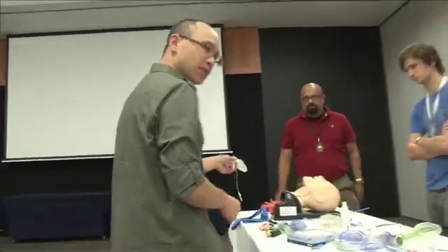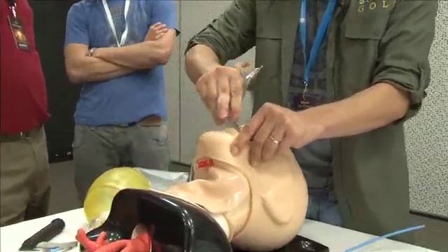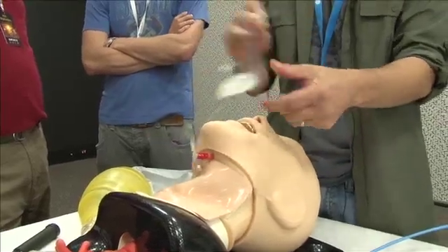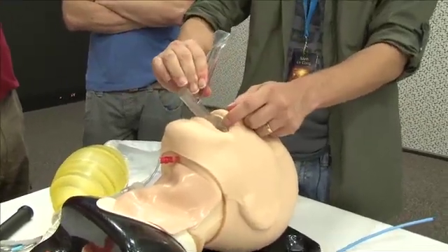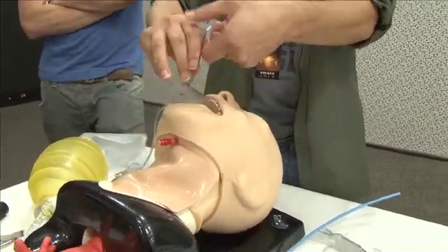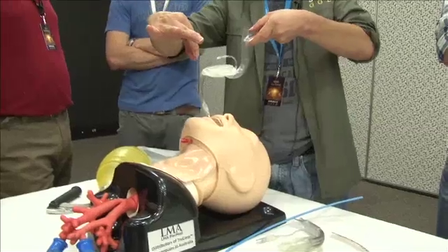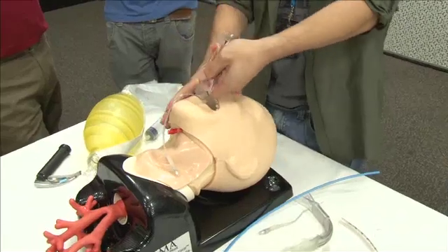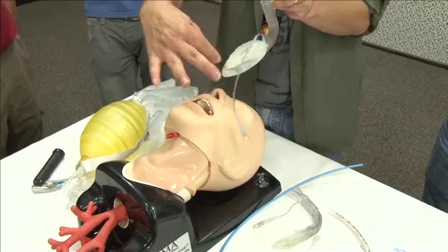Putting them in is just like a standard LMA - you open the mouth and rotate it in. The biggest problem with that technique is the cuff will fold back. So if you put it in and can't ventilate, the first thing is to do the in-out manoeuvre - slightly out, then reinsert. The next thing, if you're having trouble ventilating, is to do the Chandy manoeuvre - grabbing the handle and pulling it closer to the larynx as you're ventilating. That will help not only ventilation, but also get you closer to the larynx to intubate.